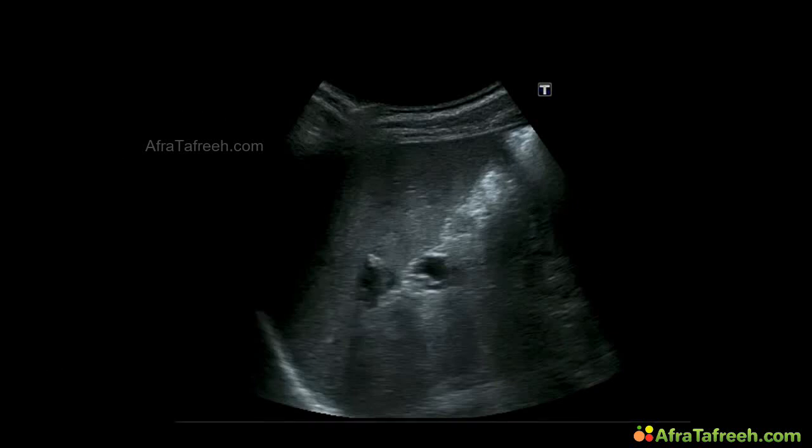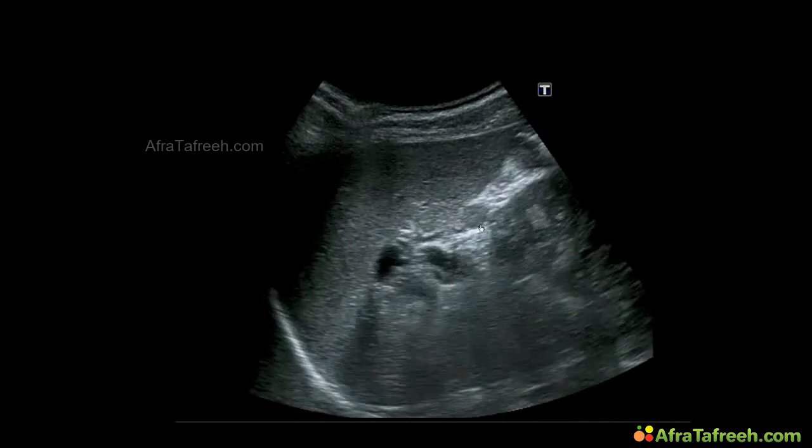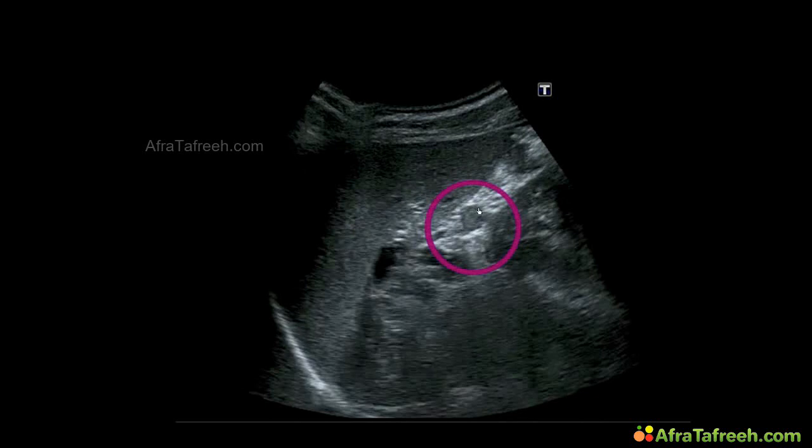It's accessory spleen. Also in the clip, we can easily detect this round-shaped little tumor near the spleen and with the same texture than we see over here in the parenchyma of the spleen.